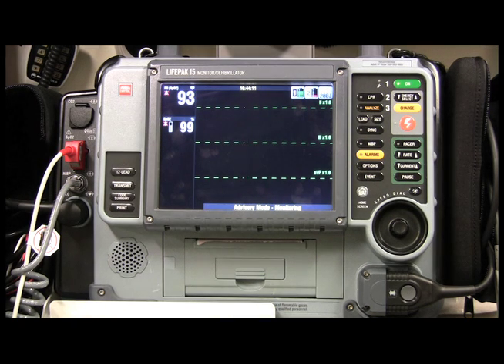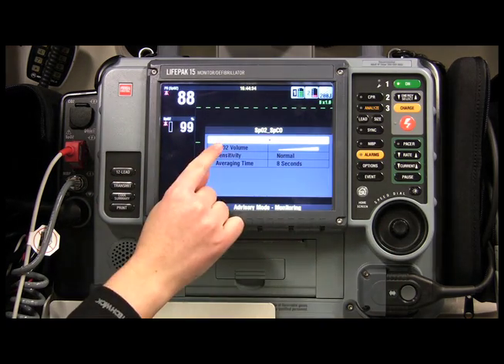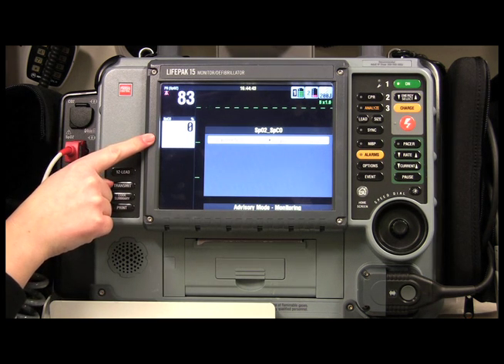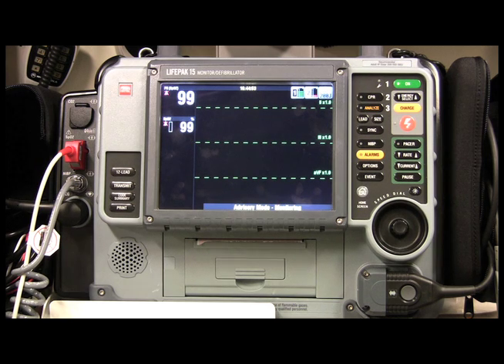I mentioned that carbon monoxide can give you abnormally high readings with pulse oximetry, so I want to check my carbon monoxide levels — and this is a great feature of the LifePak 15. I come back to the dial, highlight SpO2, click on the parameter, select SpCO, click on it, and in a couple of seconds it tells me my carbon monoxide reading, which is 0%. That's fantastic — not worried about carbon monoxide poisoning.